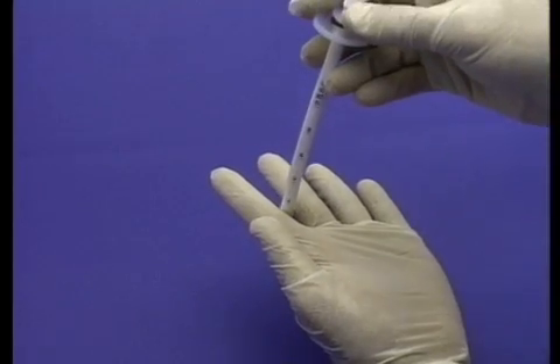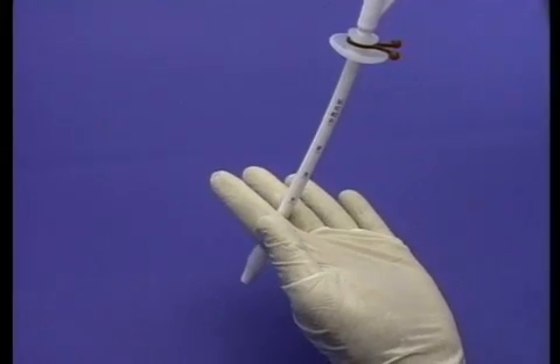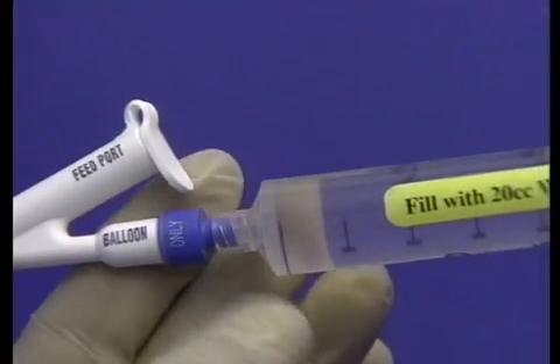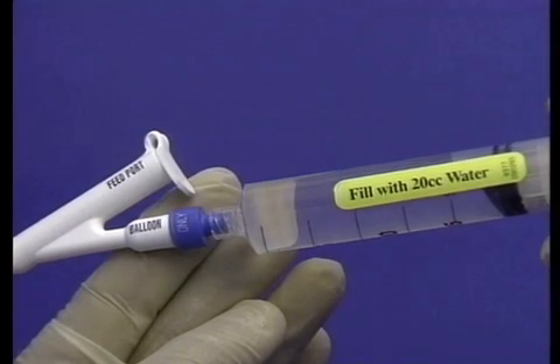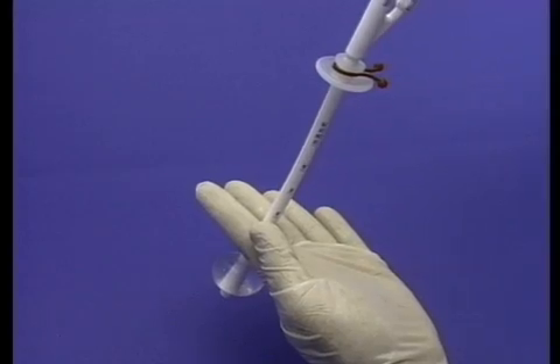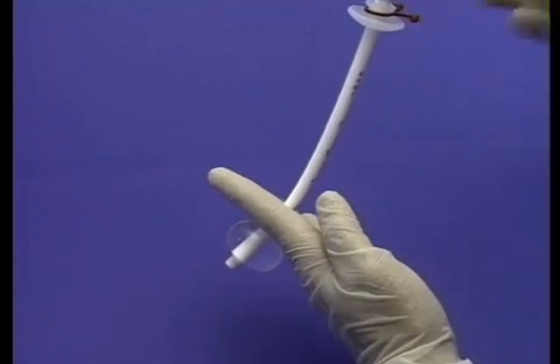Gently advance the tube into the stoma site until the balloon is completely in the stomach. Inflate the balloon with 20 cc's of sterile water through the blue access port labeled balloon. Withdraw the tube gently until tension is felt as the balloon rests against the stomach wall.